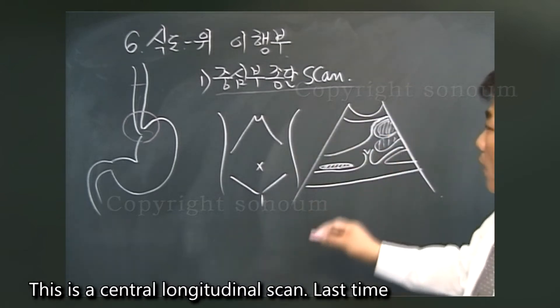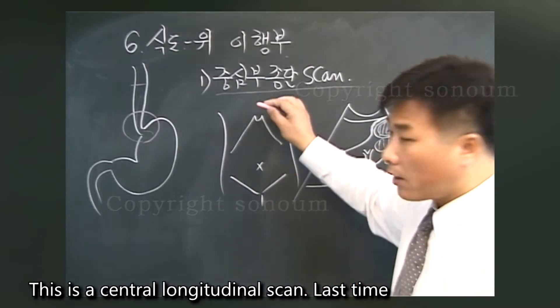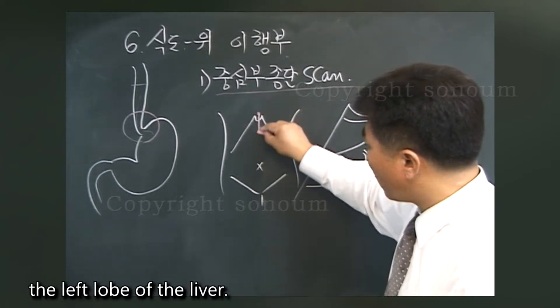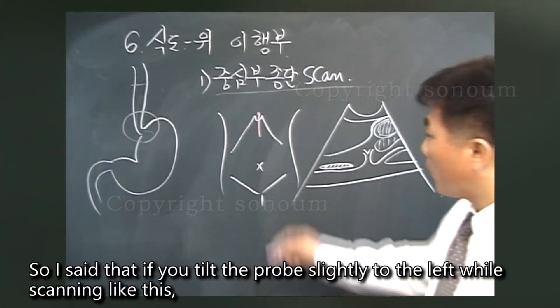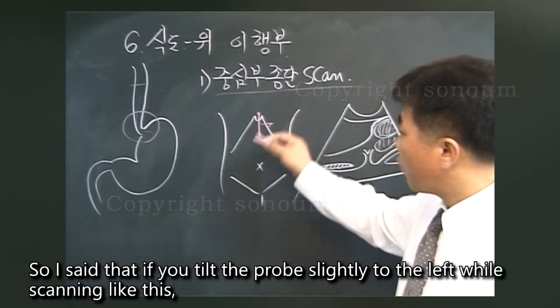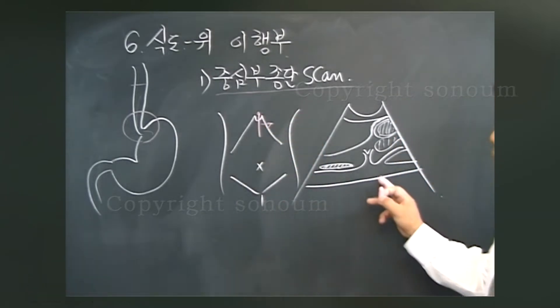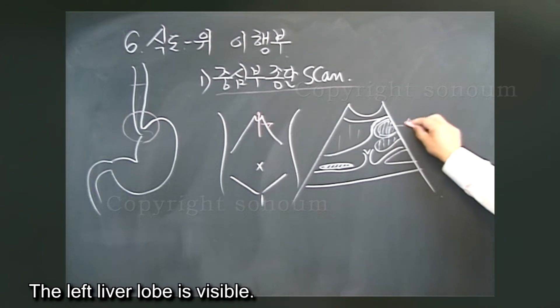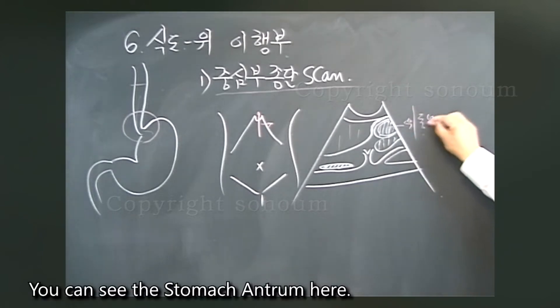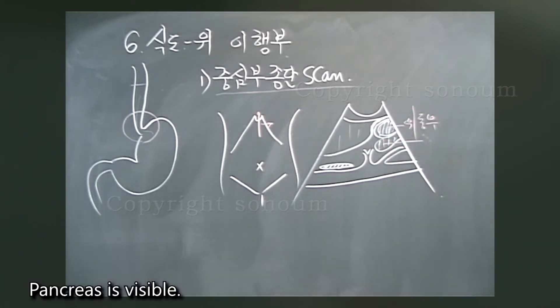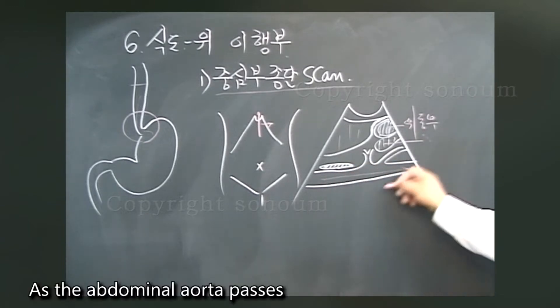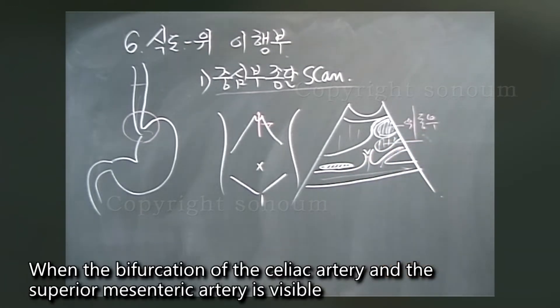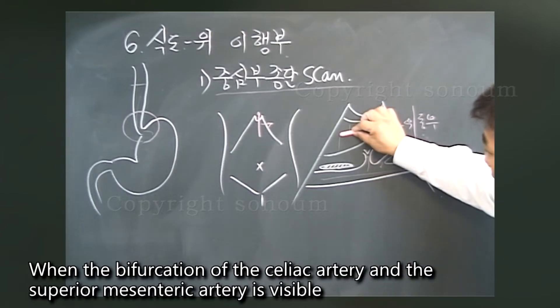This is a central longitudinal scan. Last time we studied how to longitudinally scan the left lobe of the liver. If you tilt the probe slightly to the left while scanning like this, you will see a picture like this. The left liver lobe is visible. You can see the stomach antrum here. The pancreas is visible. As the abdominal aorta passes, the bifurcation of the celiac artery and the superior mesenteric artery is visible.